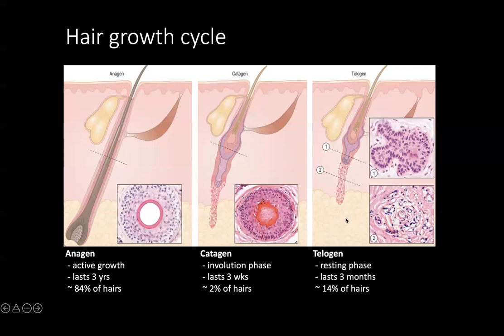You often have more telogen in hair follicles and miniaturized hair follicles, even in alopecia. That's due to hormone imbalances. So in androgenic alopecia, you may have a little bit of an anagen to catagen to telogen shift, but you're going to have much more miniaturized hair follicles. You can still have plenty of hair follicles in androgenic alopecia that are in the anagen phase. And in most conditions, if it's a non-scarring alopecia, you'll see a lot of anagen hair follicles still, because again, most of your follicles are in anagen hair. So you've got to look for other clues to be able to diagnose the pathology. And we'll get into alopecias much more later in the year.